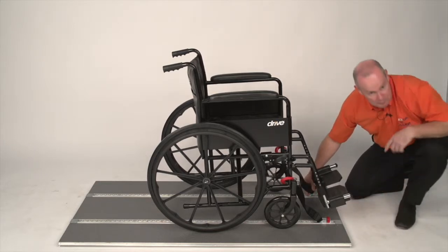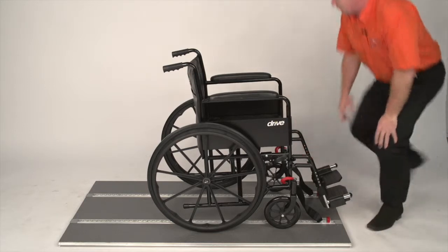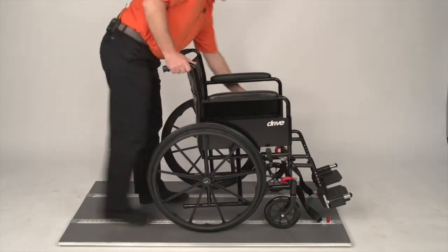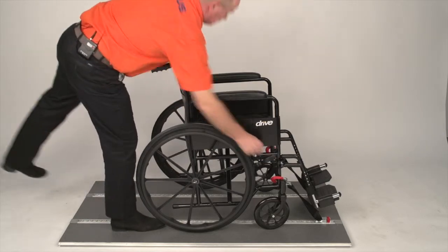The front straps need to be opposite each other in the rail. Come to the rear of the wheelchair because they are non-adjustable. Remove the brakes, pull the wheelchair towards you, then put your brakes back on.